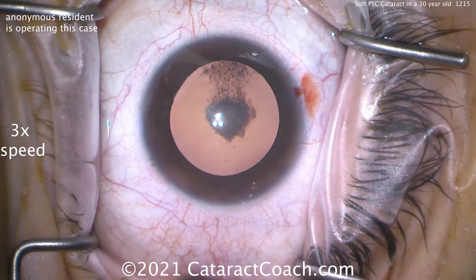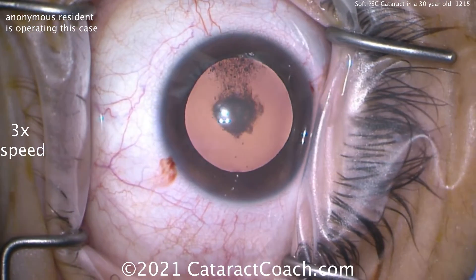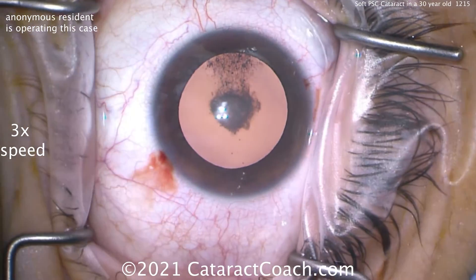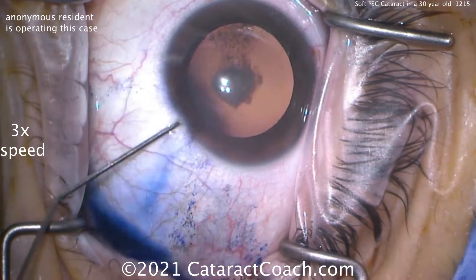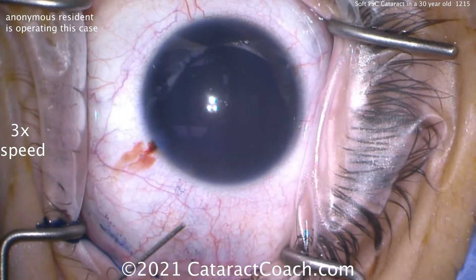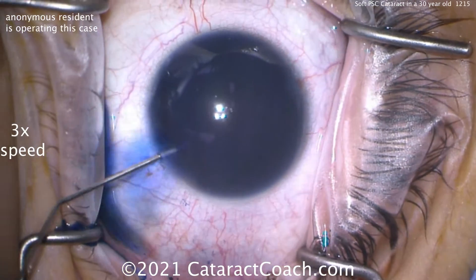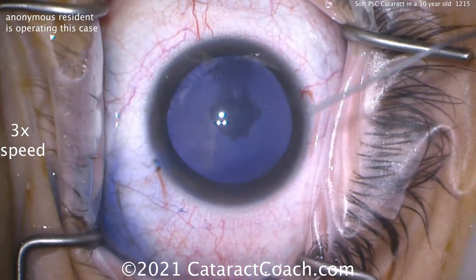One paracentesis was made for the attending, and then here's another paracentesis made by the resident. Notice how both incisions barely nick the limbal vessels? That's what we want. When you operate on a 30-year-old, your surgery has to last for 70 years. By having incisions that barely nick the limbal vessels, you're going to get long-term sealing that's fantastic.